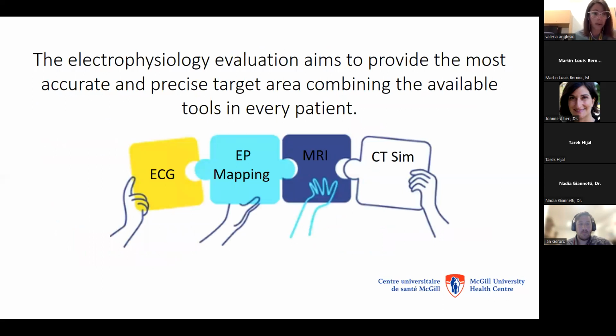So our purpose as electrophysiologists to help in this part of the study is to identify and evaluate the persistent target, to combine all these tools we have to give the information of what's the most accurate and precise target spot to do the ablation. Thank you.